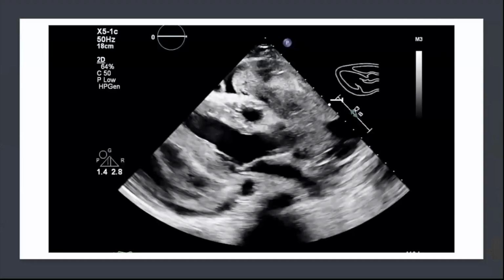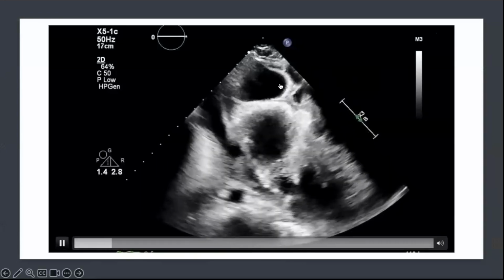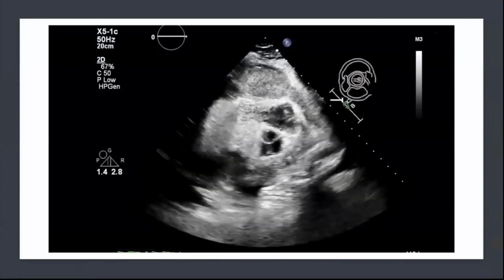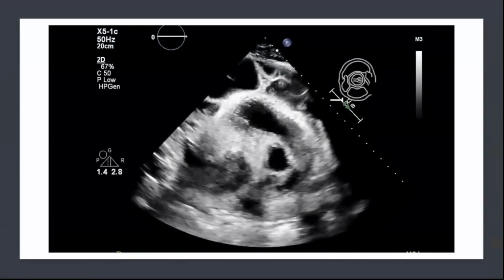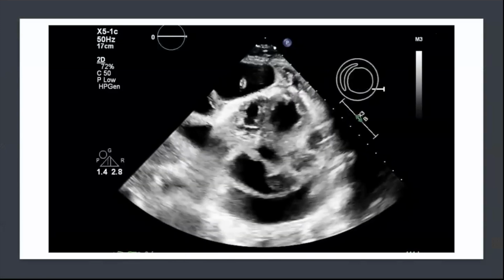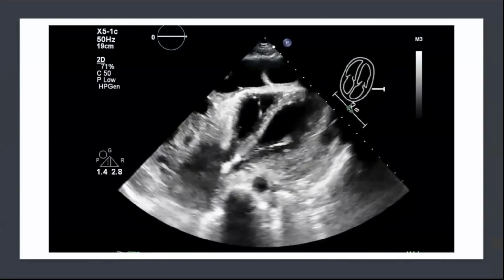So this is his repeat echocardiogram 4 weeks later, and what you can see, there's something here now that wasn't there, and his pericardial effusion is now quite complex compared to how it looked before, but he has a big mass sort of sitting over the right atrium now that wasn't there previously. And when you see the subcostal, it's actually quite impressive. It'll come in just a second.